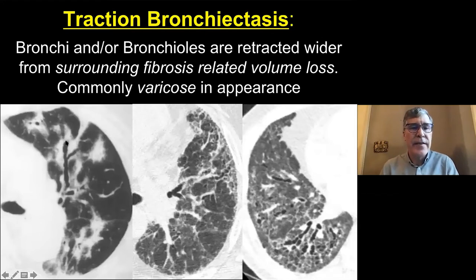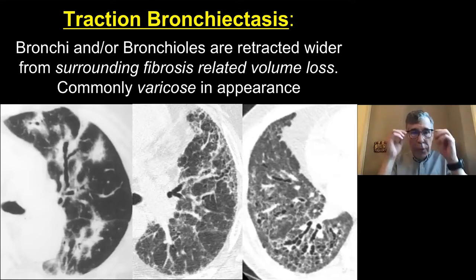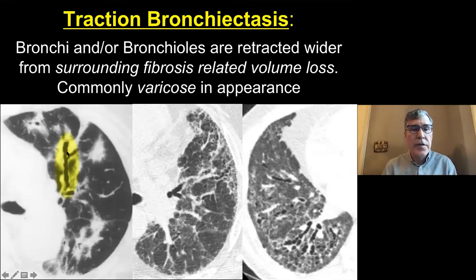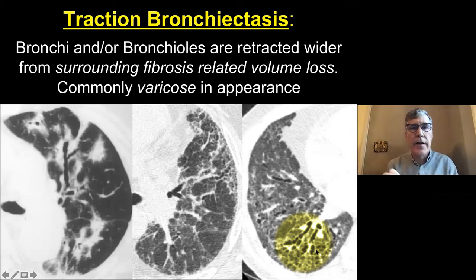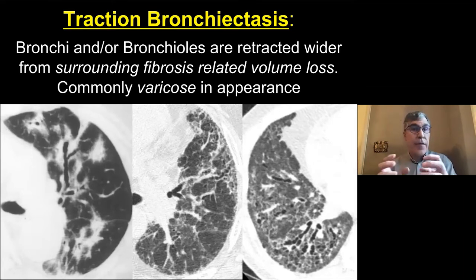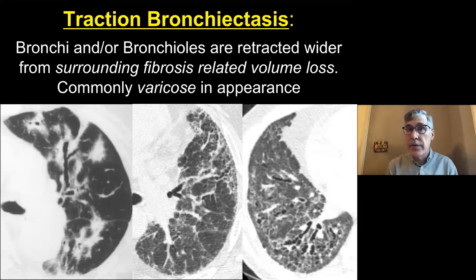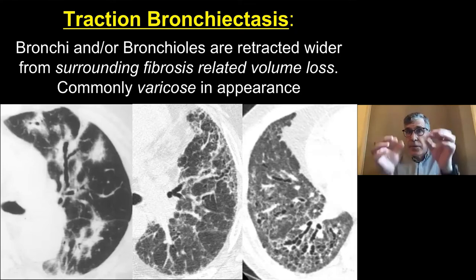Traction bronchiectasis can be seen with any cause of scarring or fibrosis. This patient has cryptogenic organizing pneumonia with chronic consolidation — you can see how the airways are being pulled apart. Being pulled apart by the reticular opacities — that's traction bronchiectasis, a very good sign of underlying fibrosis. It's not an airway problem; the airways just get pulled apart. Traction bronchiectasis is almost always varicose in appearance because of the different attachments being pulled apart.